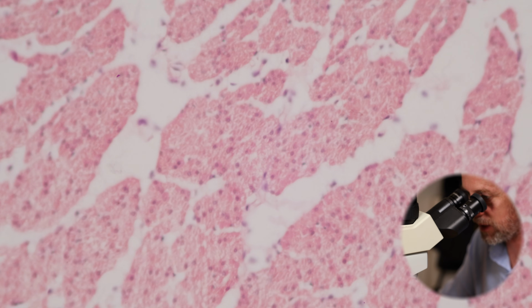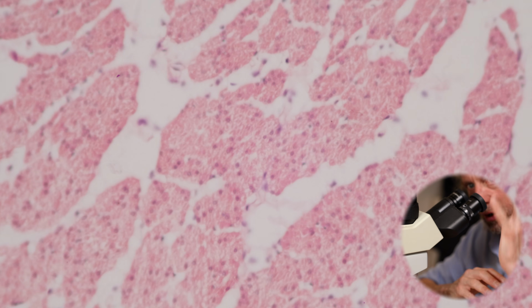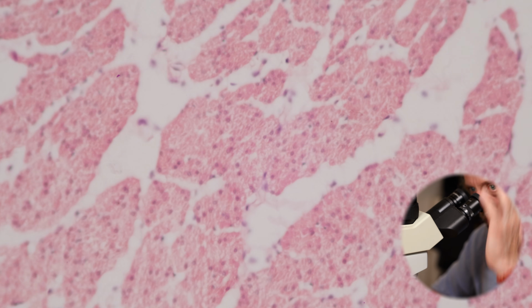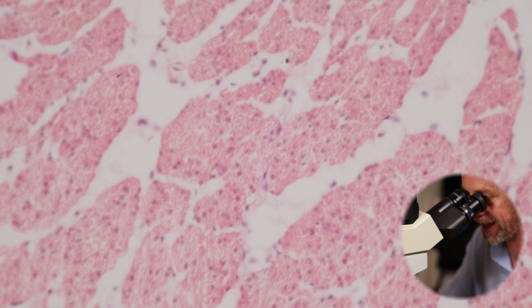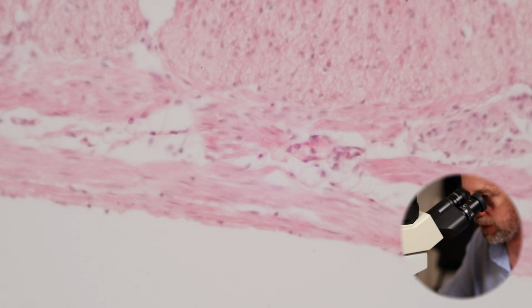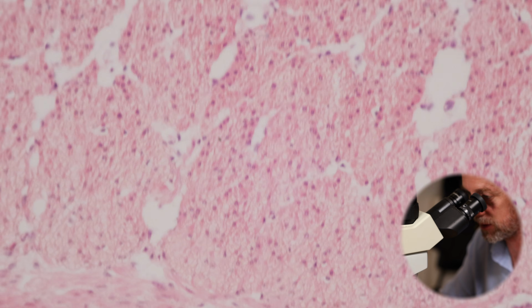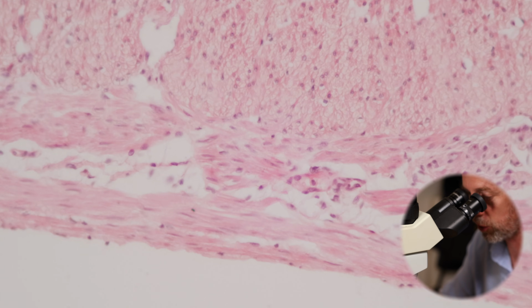So can you see that in this section this is a transverse section through bundles of muscle fibres running in that direction. So that's a transverse section through the next layer of muscle, and then out here, this is a longitudinal section through this layer of muscle there. So we've got those two layers of muscle, just as we saw in the esophagus and just as we'll see through the rest of the GI tract.